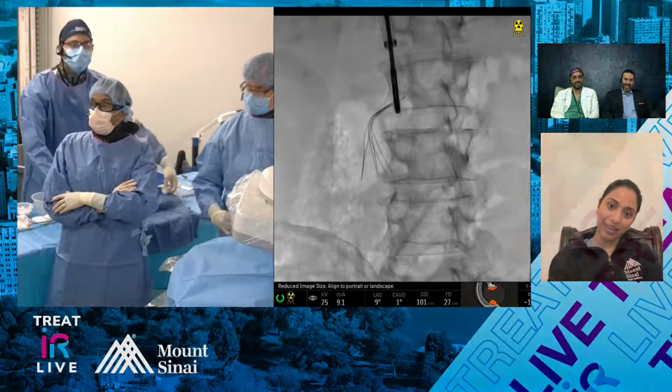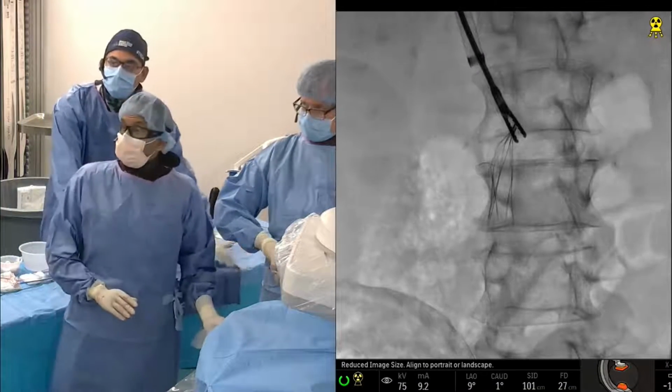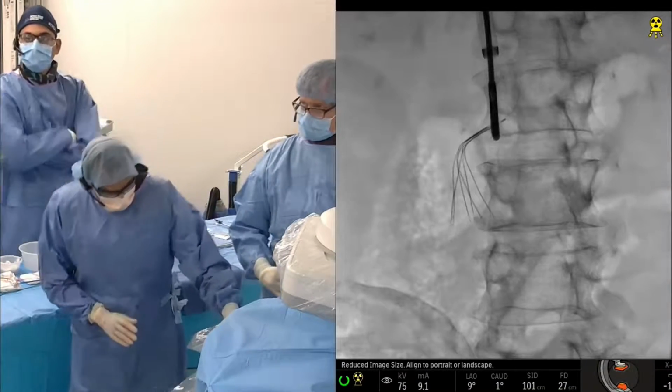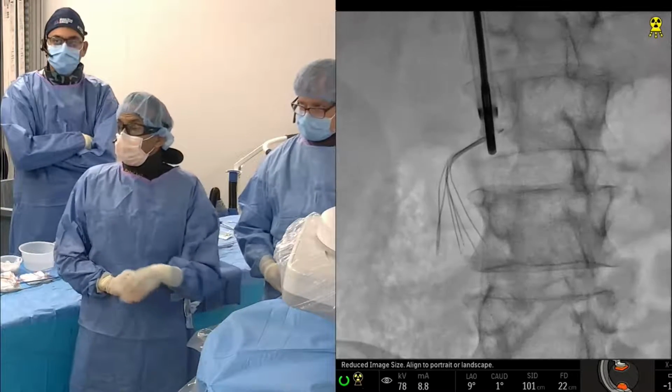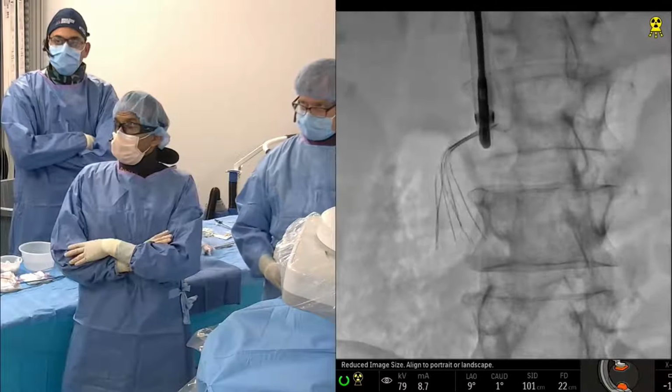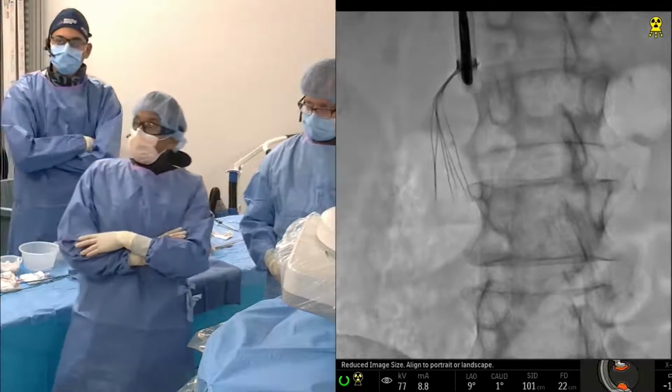There you go. Yeah, promising. Good. You can see right down the barrel there. Definitely. Like a mama tiger getting her cub by the neck. And now it's just brute force, right?